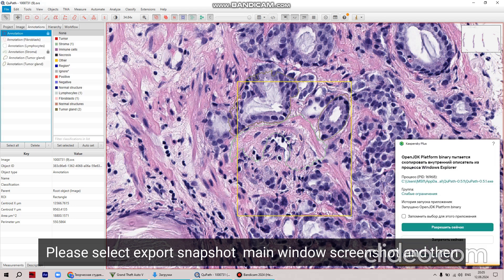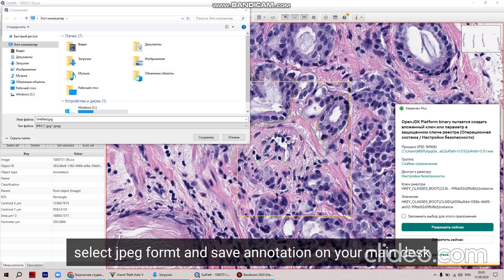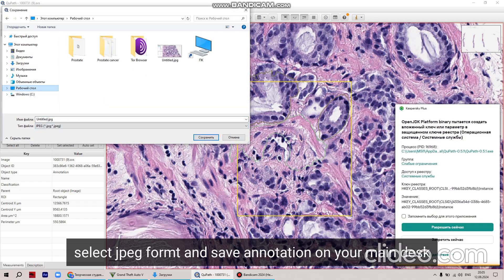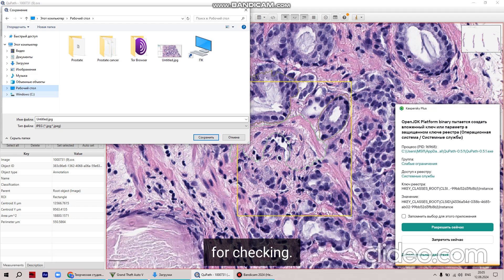In order to create drawings inside this rectangle, you have to lock this annotation. Then you choose a tool — it may be the magic wand, brush, line, or polyline — whichever tool you like.